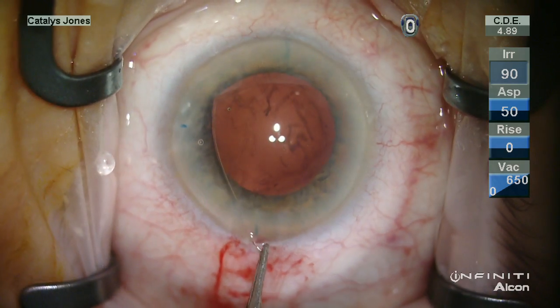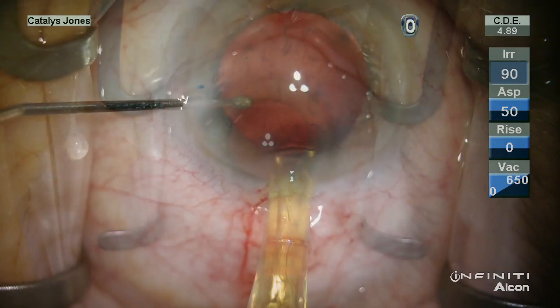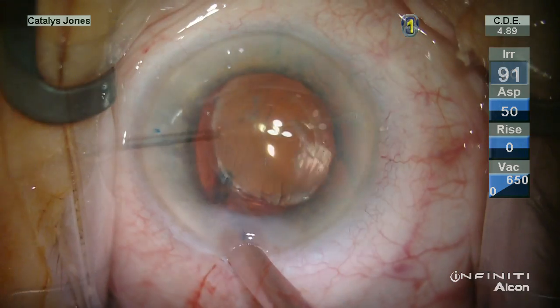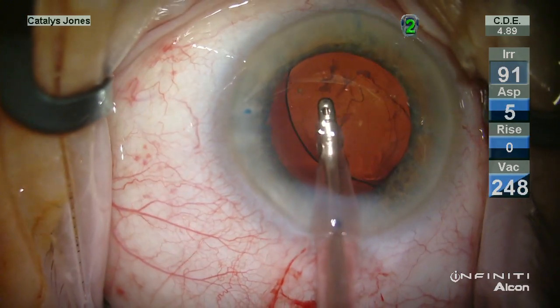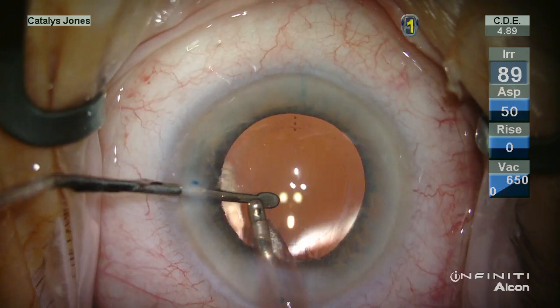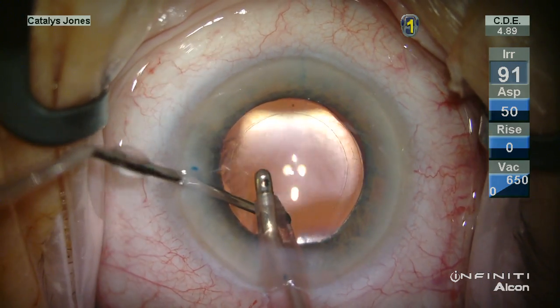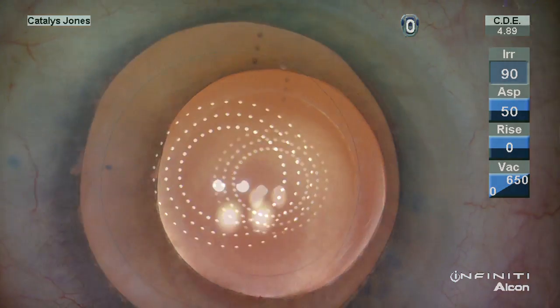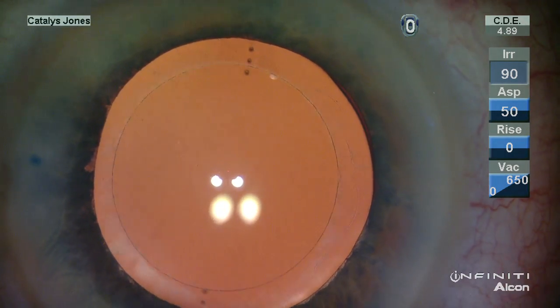Everything appeared very stable during the surgery. However, I do like to ensure we will have as much stability for as long as possible, so I placed a capsule tension ring. This T6 single-piece acrylic toric lens is placed in the capsular bag. The viscoelastic is evacuated posteriorly and then anteriorly, and using a second instrument the lens is oriented properly according to the preoperative marks. At the conclusion you can witness the keratoscopic view from the Mastel keratoscope, as well as the pseudoexfoliation material on the anterior capsular bag.